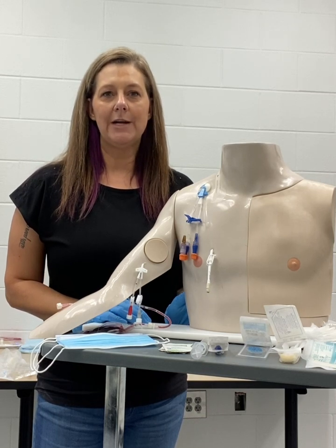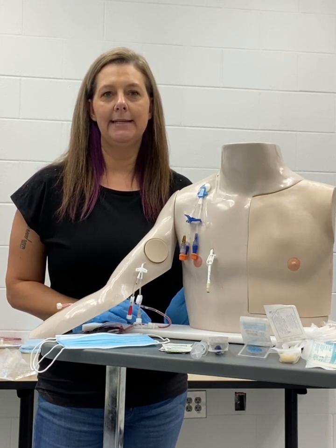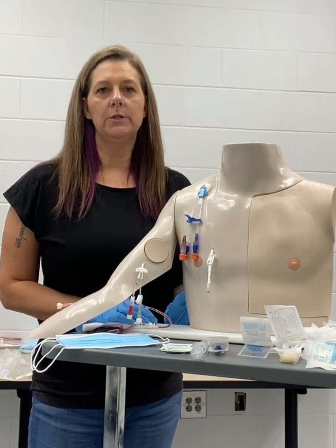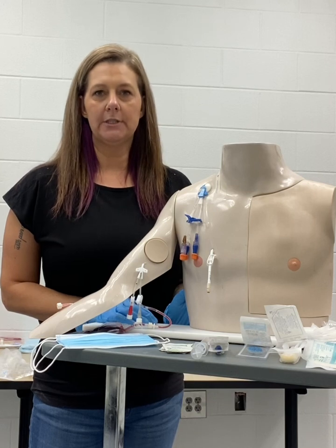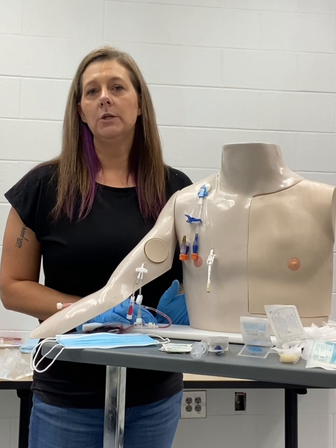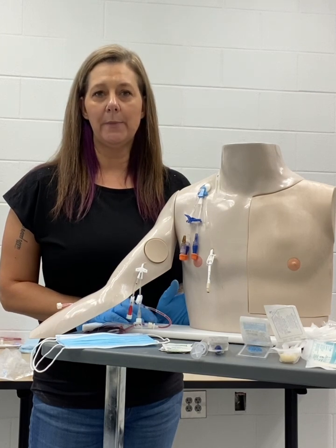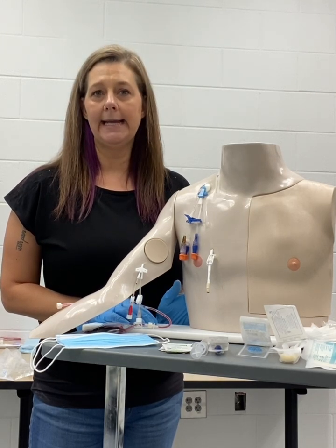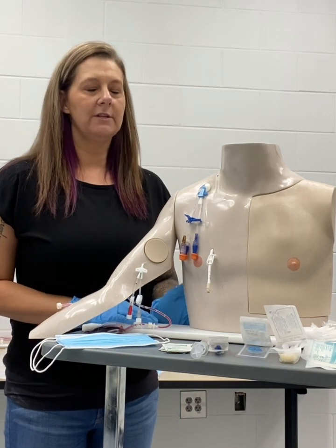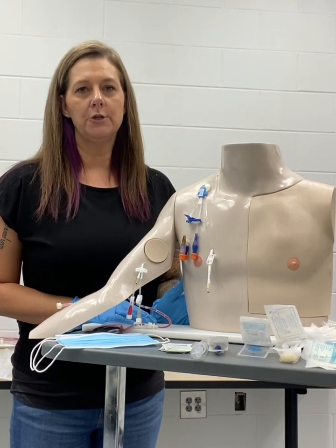This video is to show you the skill of central line dressing change and cap change. As always, when you enter a patient's room, you want to knock on the door and introduce yourself. You want to identify the patient with two forms of identification, and then we want to assess their needs, assess their pain, and ensure that all of that is taken care of prior to beginning any procedures. We always want to verify the physician's orders prior to beginning as well.